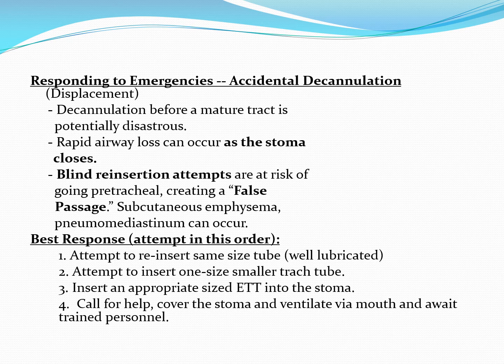patient, unplanned decannulation where the patient was rolled to one side and the tubing pulled and their trach tube came out. And particularly troubling when the decannulation occurs before a mature tract is established. That can be potentially disastrous. Rapid airway closure can occur in an unestablished stoma.